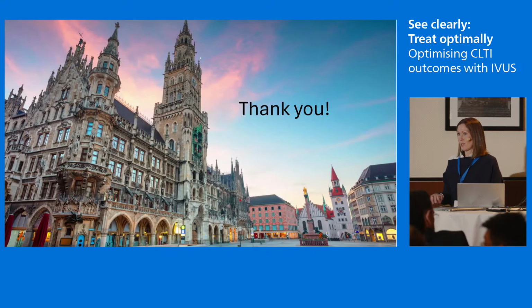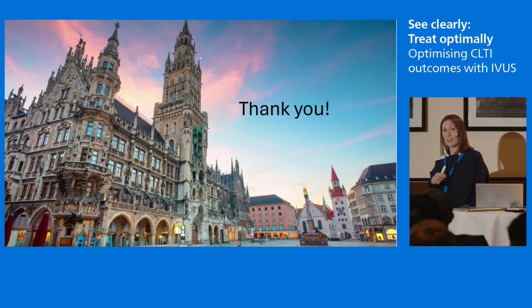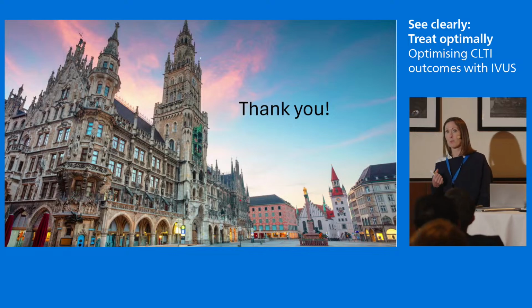So in conclusion, even in non-expert hands, I think IVUS helps me to improve the quality of what I do, both on table and potentially post-op. I think it does improve the quality of angios that I can provide so that I can hopefully treat a patient once and well, and that potentially has benefits for that individual patient, but also potentially for the health system if you're not bringing people back for repeated interventions. So even in non-expert hands, I've found it a really useful adjunct to my practice. Thank you.